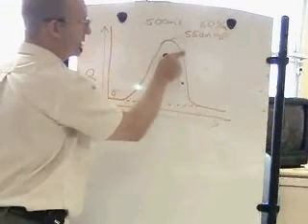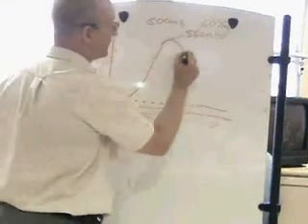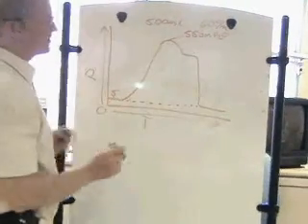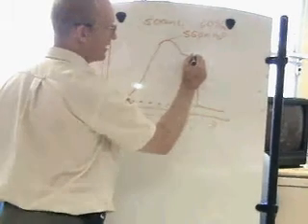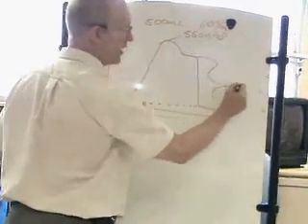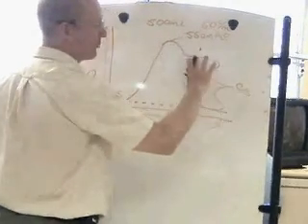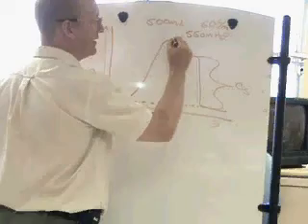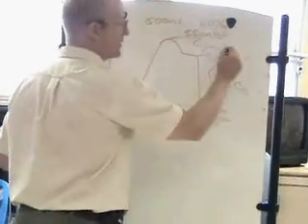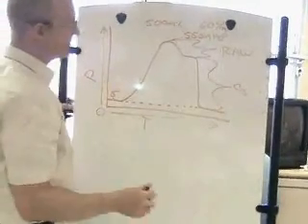And when you do the inspiratory pause, you would find that you separate this pressure scalar into 2 different levels. Okay? In which it would look something like that. And we just described that this level, the plateau pressure, down to your baseline pressure, would be the pressure used to overcome static compliance. It is not static compliance, it is the pressure used to overcome it. And then this level from here to here is going to be the pressure used to overcome airway resistance. It is not airway resistance, it is the pressure used to overcome it.